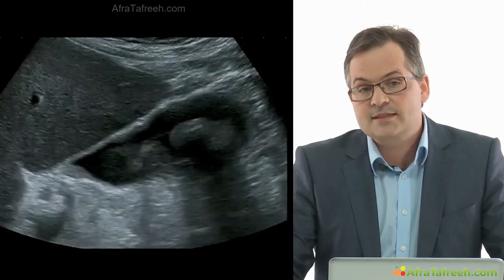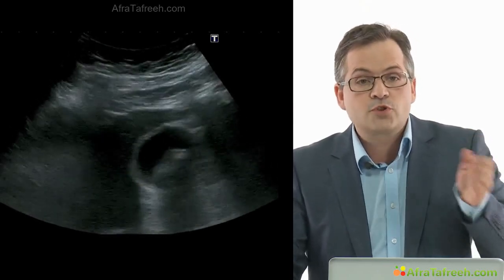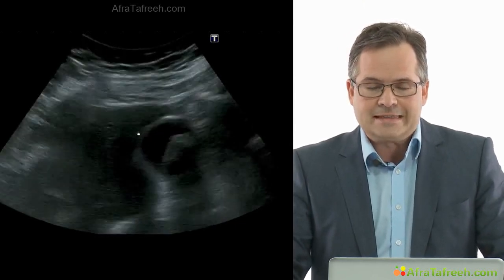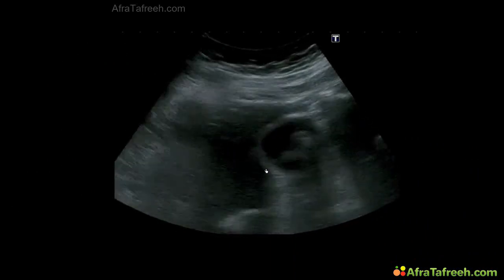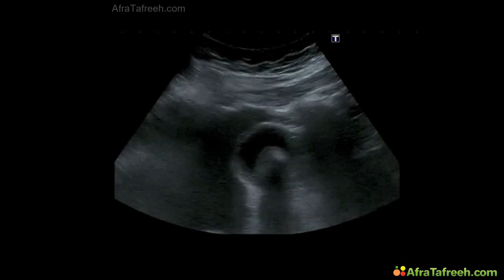So the next step, I try to test for the sonographic Murphy sign. I push the probe against the patient's abdomen in the region of the gallbladder, and this test was really positive. Patient complained about very intensive pain over there and was sent to the operation theater for a cholecystectomy.